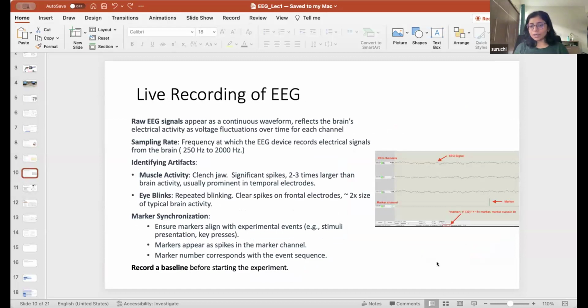Both of you are not doing it right now, so we don't have to spend a lot of time on it. Actually, the Gayatri Mantra study needs that, I think, E-Prime. Yes, he cannot do it without it, right? Every time someone is seeing something positive, you can't be fast enough to send a marker in 200 milliseconds. So it's not possible to do that manually.